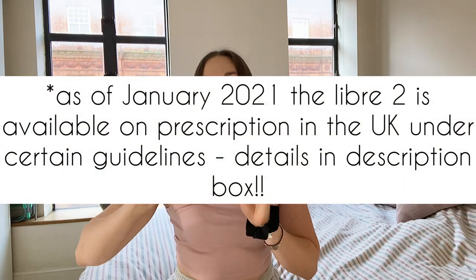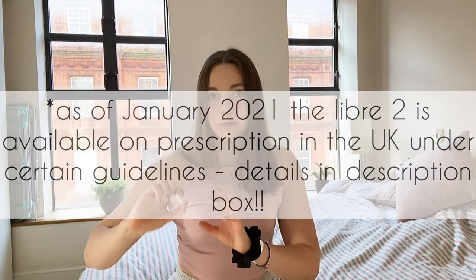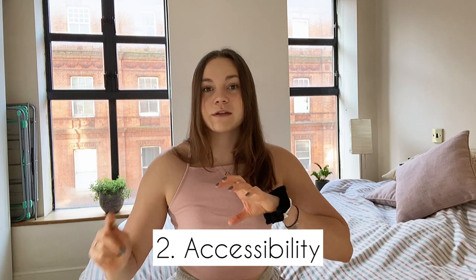One thing to note is that this review is for the Libre 1. There is now a Libre 2 and I believe even a Libre 3, but I personally cannot yet access the Libre 2 or 3 on the NHS. The Libre 2 and 3 are both continuous glucose monitors, so they will send alarms to your phone, which leads me into the second thing I want to discuss: accessibility.